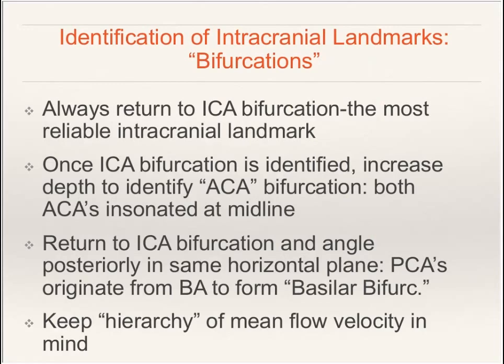Okay. So the bifurcation landmarks are the most critical ones to pay attention to. Always return to the ICA bifurcation. That's the most reliable landmark. Once that has been identified, look at the ACA bifurcation, where you're looking at both ACAs being insonated, and then return to the ICA bifurcation and angle posteriorly to look at the PCAs.